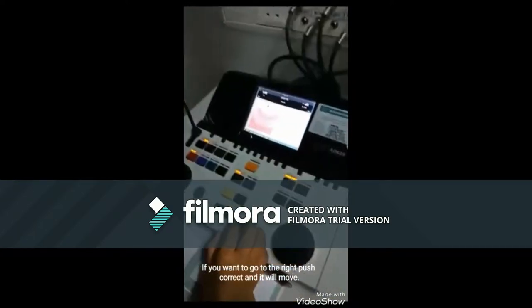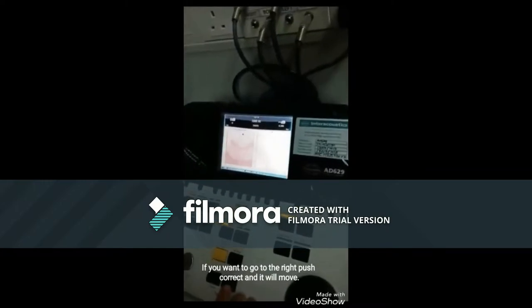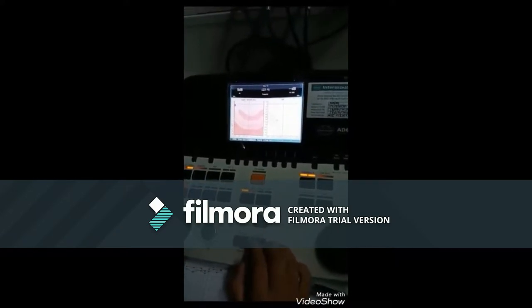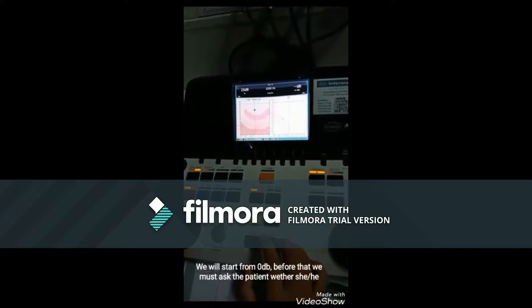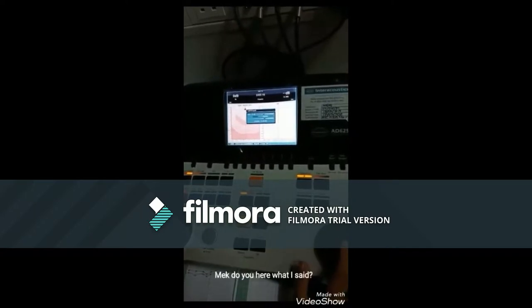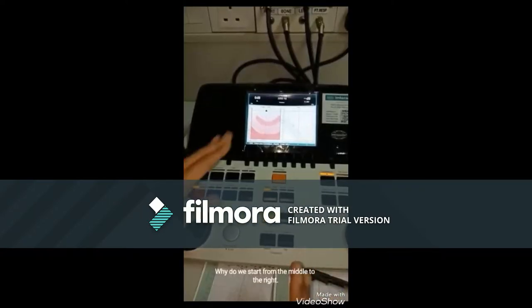We will start from the middle first and then to the right and to the left. If you want to go to the right, place this one, push correct, and it will move. But incorrect, move like this. Okay. So we will start from 0 dB. Before that, we need to ask the patient whether they hear what we say or not. Dengar. Well, we start from the middle to the right.